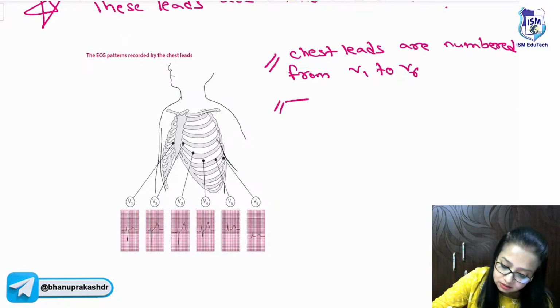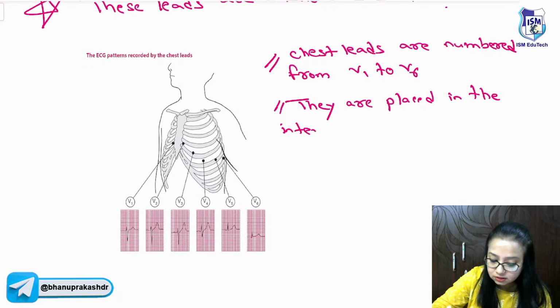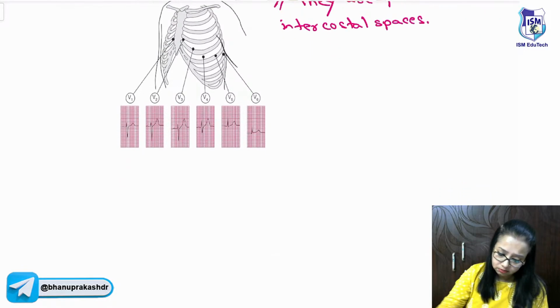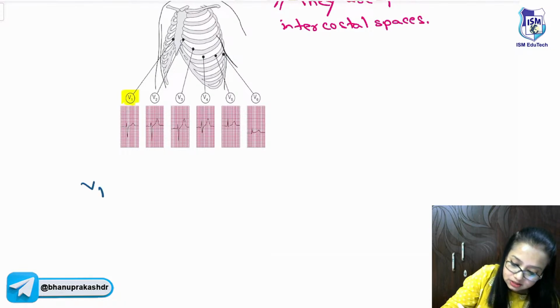They are placed in the intercostal spaces.